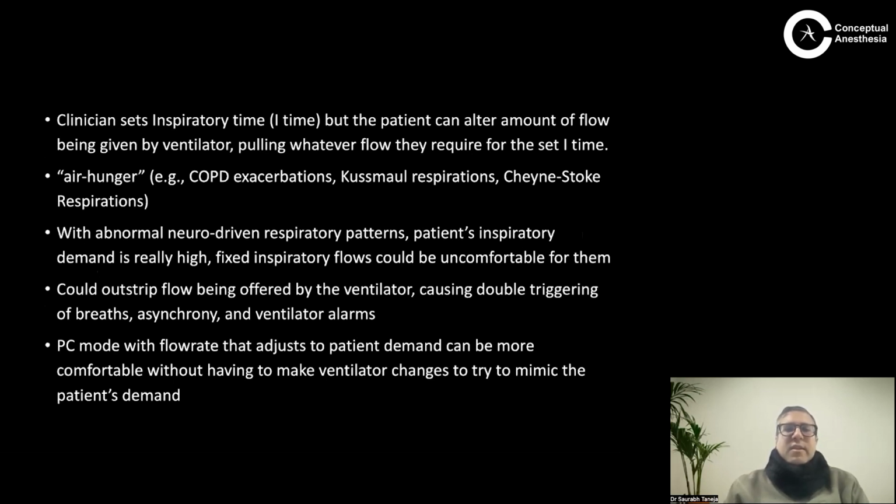So clinician, another benefit I have shown in this slide: the clinician sets inspiratory time, but the patient can alter the amount of flow. So you set an inspiratory time and a pressure, but the amount of flow that the patient can get from the ventilator can vary slightly. Patients with air hunger, like COPD exacerbation or Kussmaul's respiration, have abnormal neurorespiratory drive patterns. So demands are slightly high and fixed inspiratory flows could be uncomfortable for them.